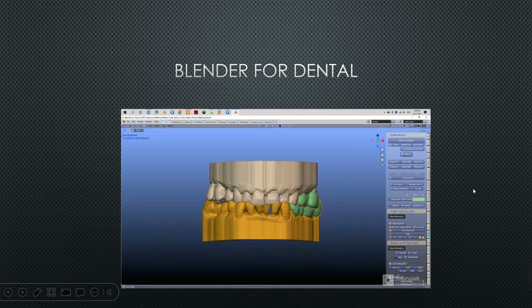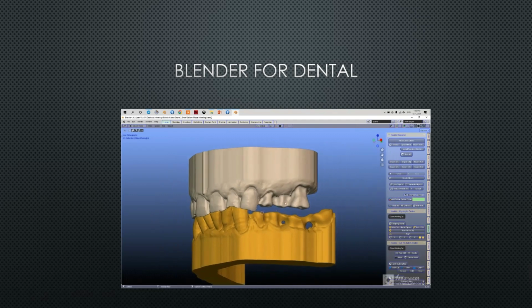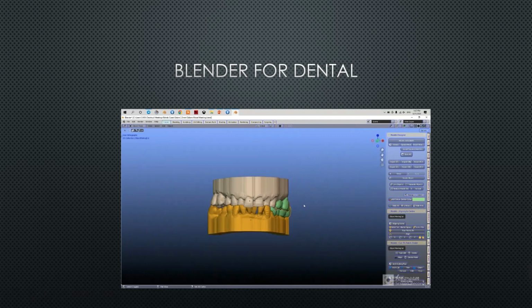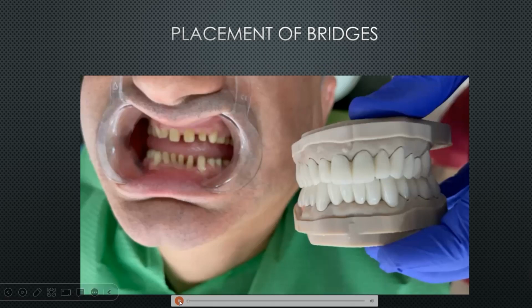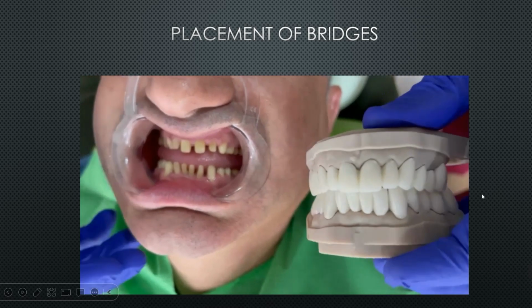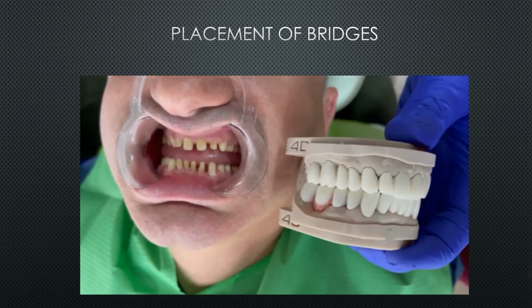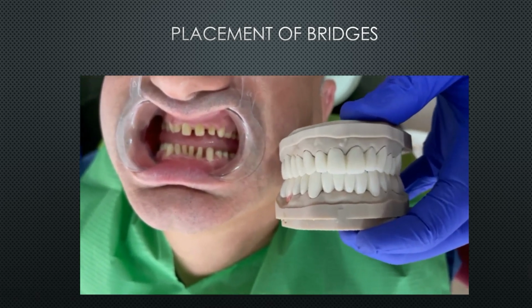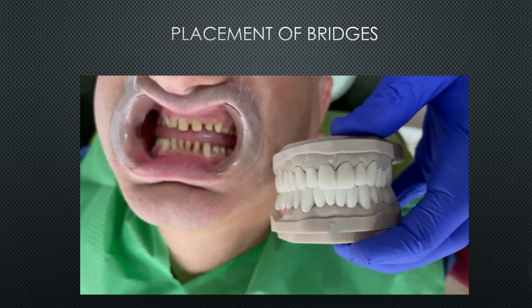This is how we open the bite, and this is making the movements on the bridges, so they are fully articulated. This is 3D printed model from Shining D1. This is the insertion. So all of the teeth inserted in less than a minute and all in occlusion without any interference.